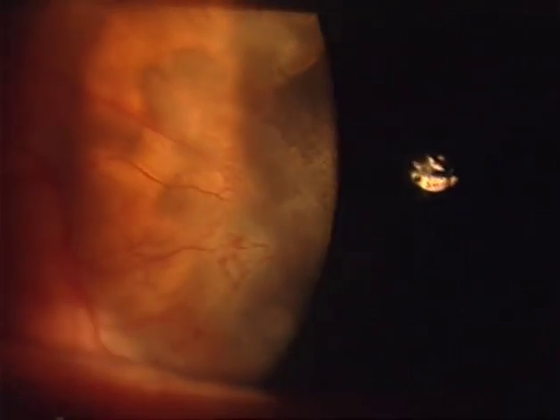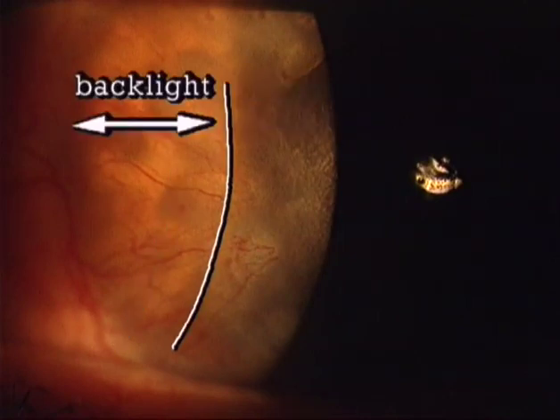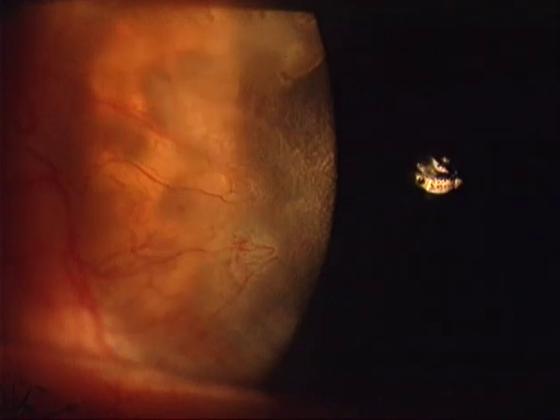On the right-hand side of the light strip, the area illuminated by direct light reveals the light-scattering properties of the scar. On the left-hand side is the area of indirect light showing superficial and deep corneal vessels against the backlight from the iris. In the central strip, direct light and indirect light overlap, and here they interfere.